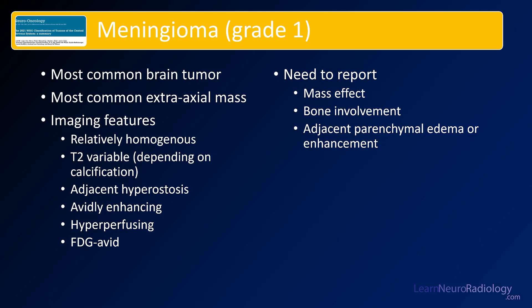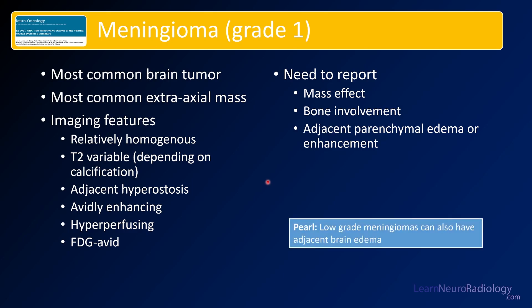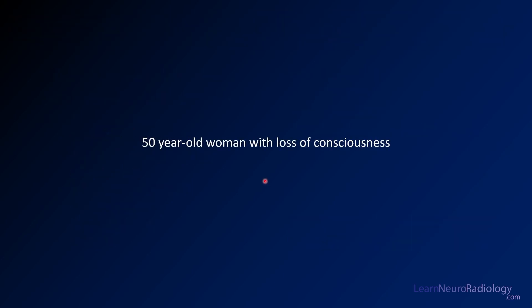Meningiomas are the most common brain tumors and the most common extra-axial mass. They tend to be homogeneous, can be T2 variable but often T2 hyperintense, and you might see hyperostosis. They can be hyperperfusing and FDG-avid, so don't let that confuse you into thinking it's definitely a metastatic lesion. Report how much mass effect there is, bone involvement, and adjacent parenchymal edema or enhancement — these are concerning features. This case turned out to be a grade one meningioma. Low-grade meningiomas can also have edema — that doesn't mean brain invasion or high-grade tumor. Avoid the word 'atypical' as it specifically refers to other subtypes of meningioma.